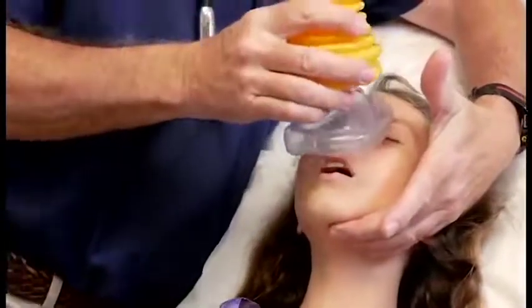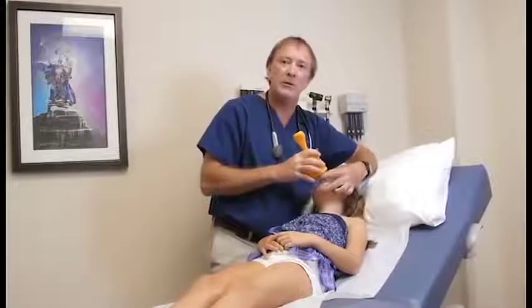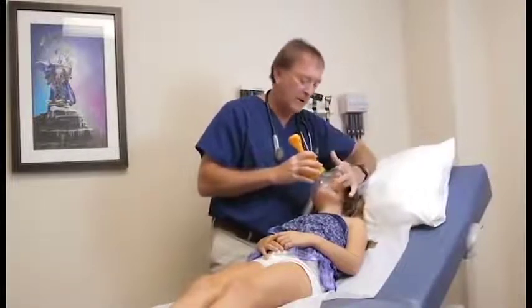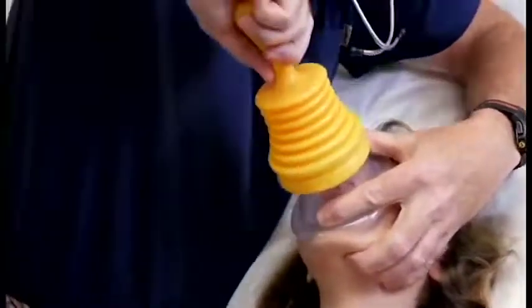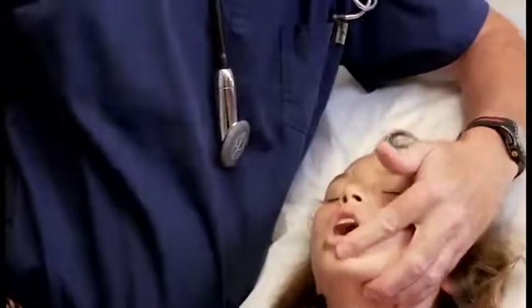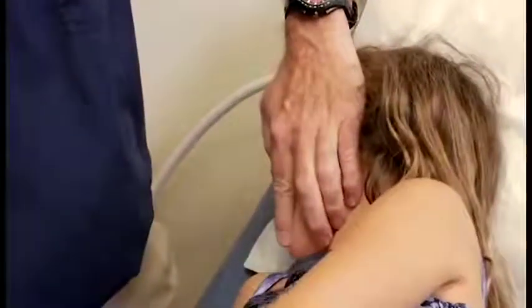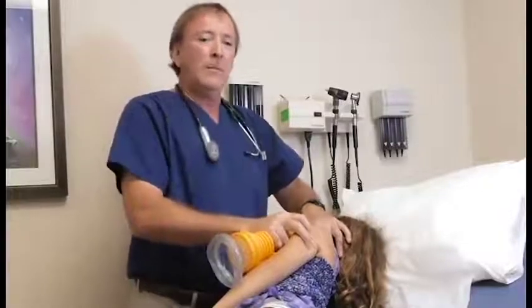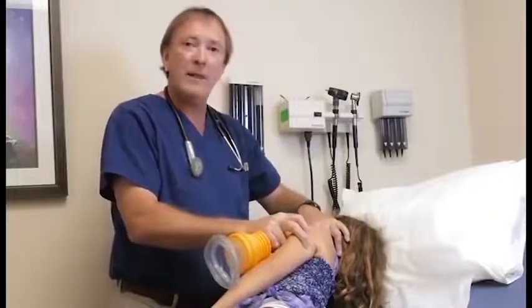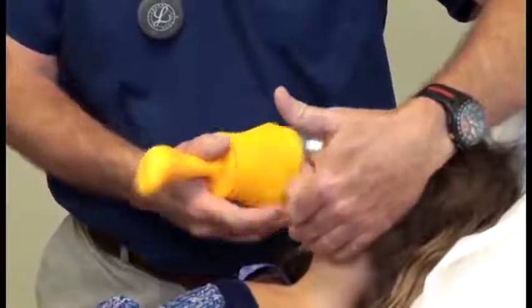Same way — start from the forehead coming down. Seal it. Sometimes the mouth will be so shut or closed you're going to have to use another finger to push in between the gum line and the teeth to open it. Push hard, pull. Again, look for a result on the side and take a second to watch — is she gasping? Typically a person will take a breath, cough, or throw up, which is another reason to have them on their side. You can use it as many times as needed until EMS or other trained medical professionals arrive.